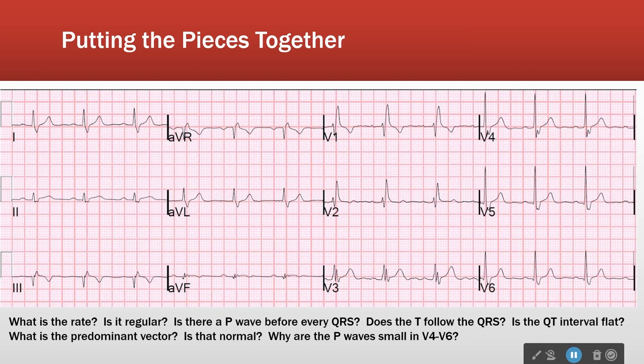And the answer is they're looking at it from the back. And between the atria, remember P waves are atrial depolarization, right? Well, when we look at the atria from the back, we're looking through the giant ventricle. So we see an attenuation of that signal, all right? So typically when you're assessing P, QRS, and T initially, look at leads 1, 2, and 3, okay? Because they're at some distance from the heart, so we get some summing of the effect.